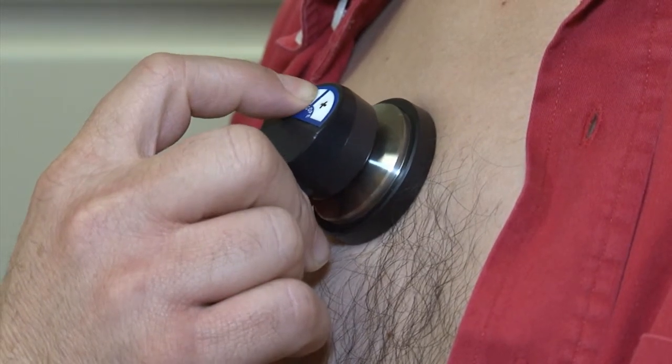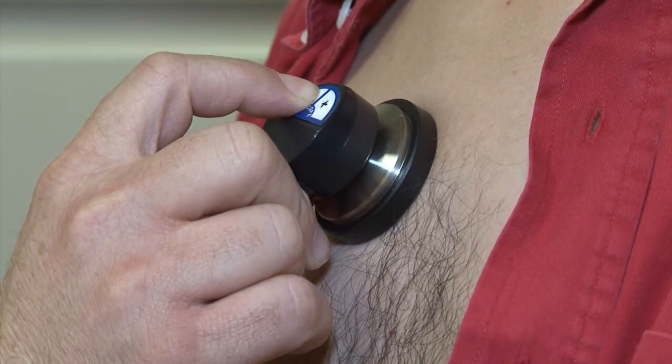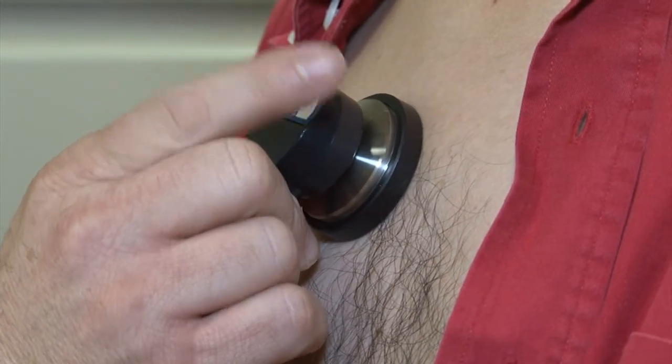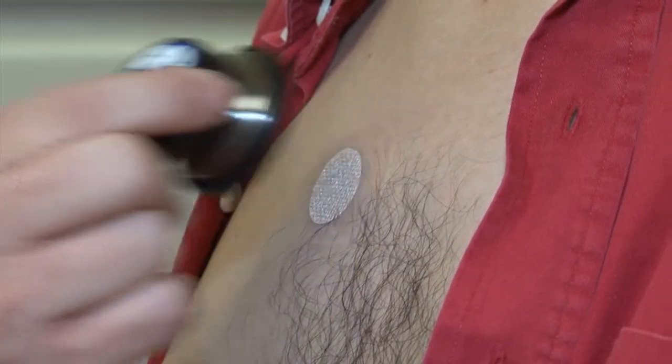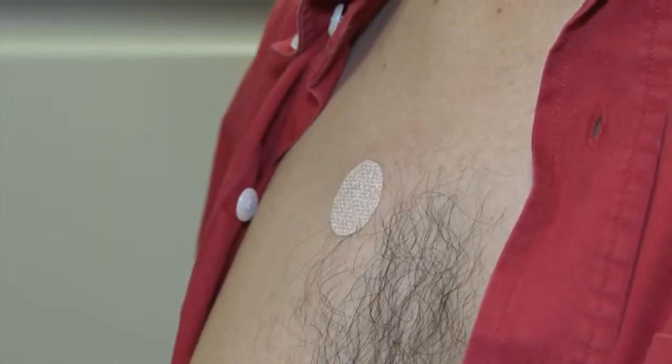The SimScope will power down 90 seconds after the last key press with a voice alert saying, System powering down.